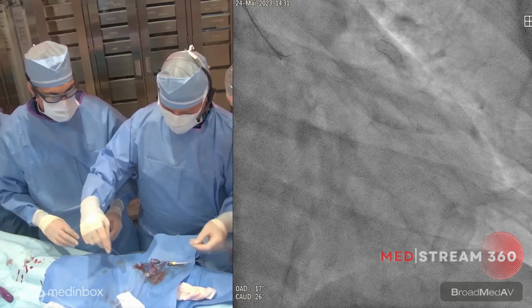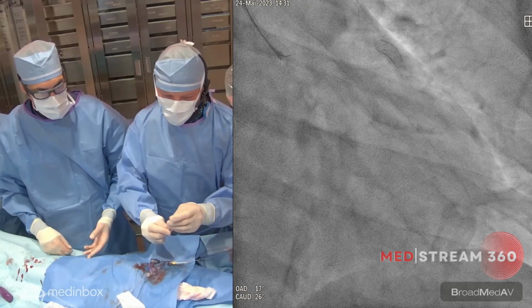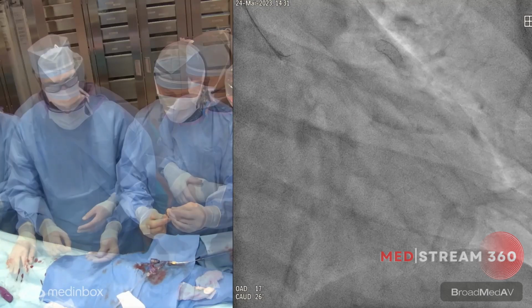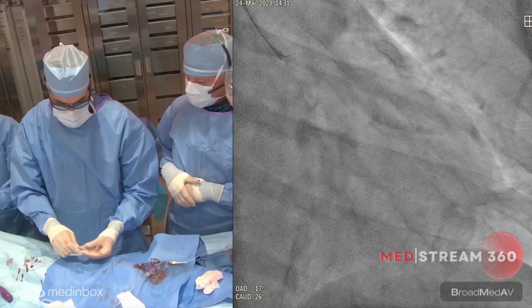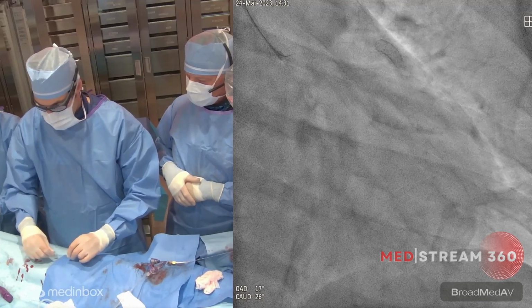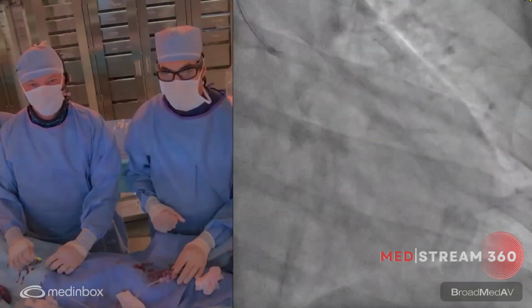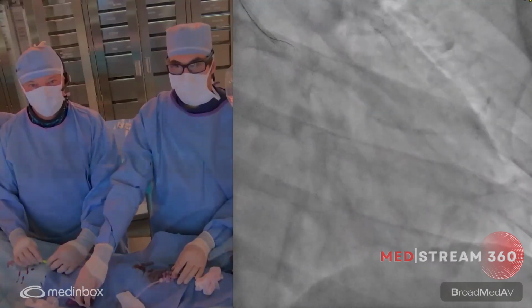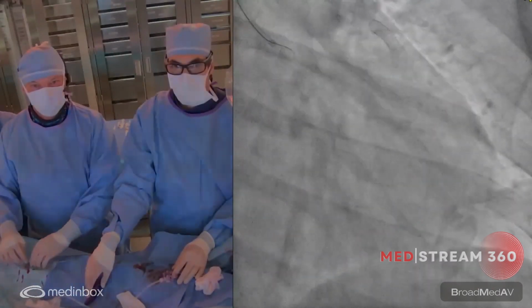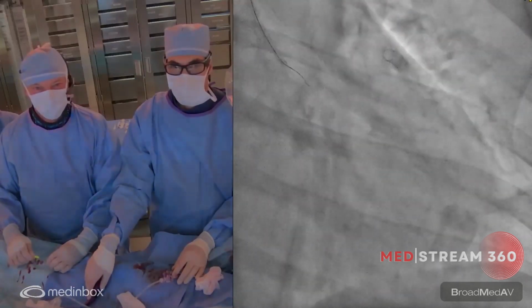Turnpike. So we'll try a microcatheter with the Fielder XT, and take time to focus on that. The wire is still okay. And obviously we're selected to try to reopen the three vessels. Now the LAD is okay, now the circumflex, and next time the RCA. With the catheter, we have better pushability.